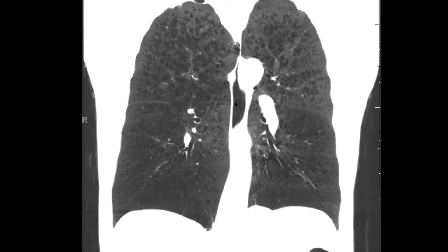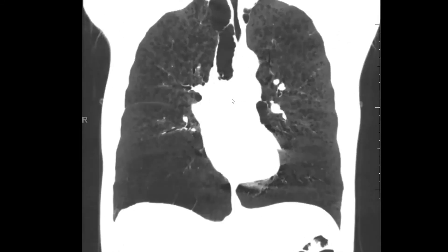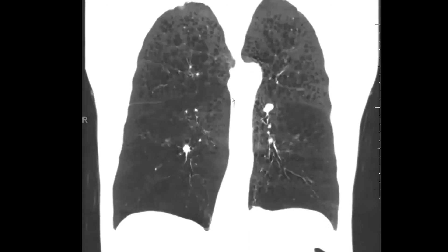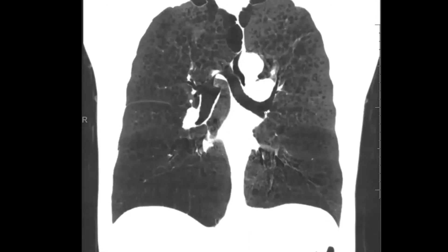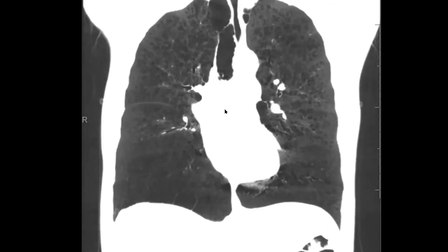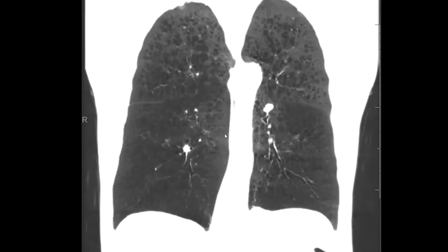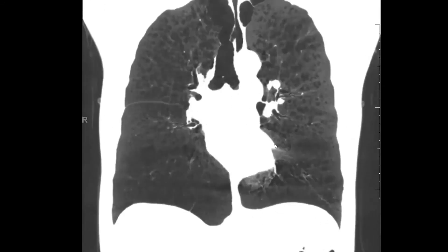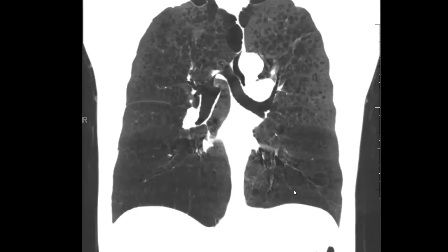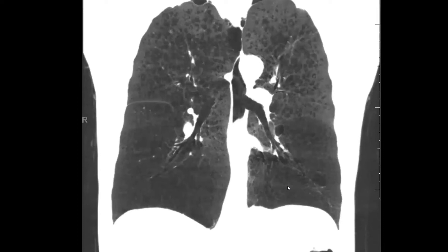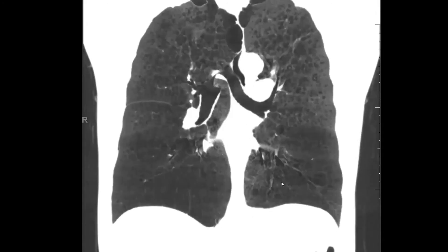Here at the University of Chicago we do MinIP imaging — minimum intensity projection imaging — in addition to maximum intensity projection imaging. MinIP brings out areas of hypodensity: within that slab of tissue being imaged, it shows you the lowest density voxel. We see areas of centrilobular emphysema in the upper lungs, and down low we see confluent hypodensity — a nice example of panlobular emphysema. Looking at the coronal formation and MinIP images together is helpful to confirm panlobular emphysema at the lung bases.